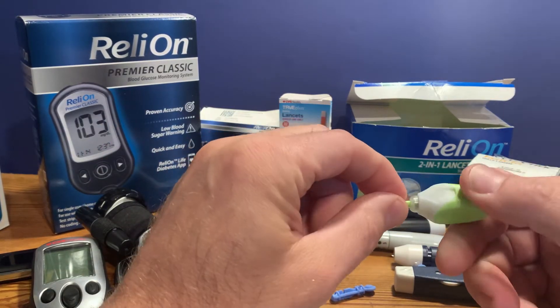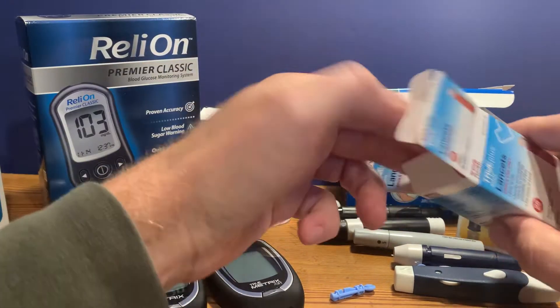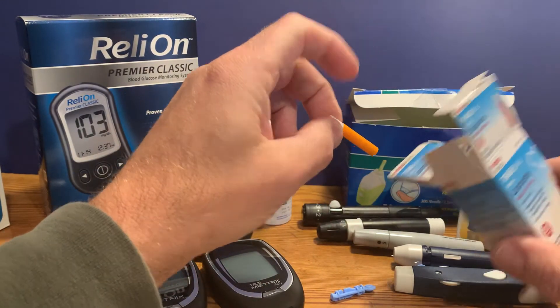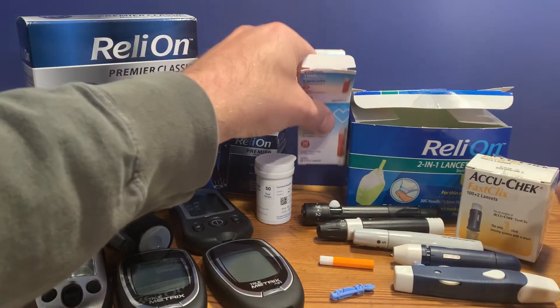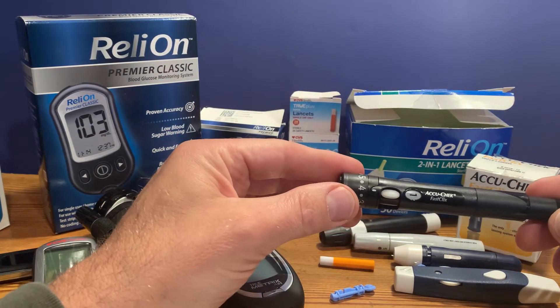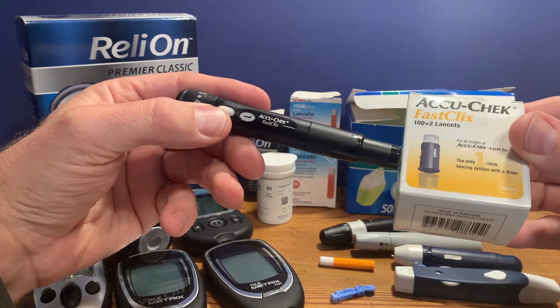CVS makes a smaller single-use lancet as well — again, simple to use. Then there are lancet devices; this one is the AccuChek Fast Click device, which is loaded with several lancets.